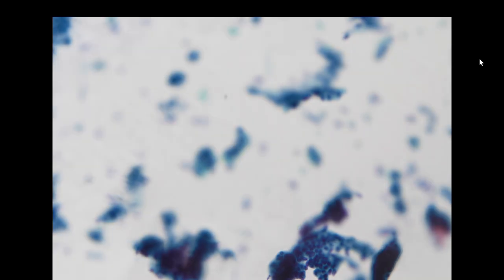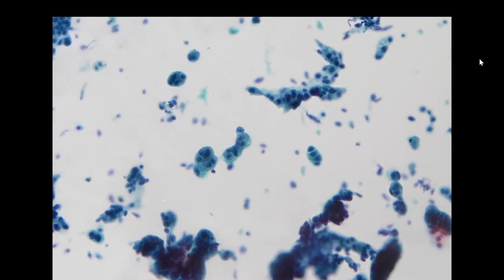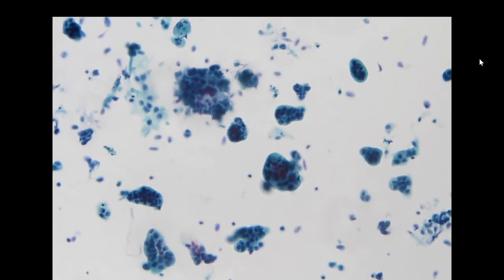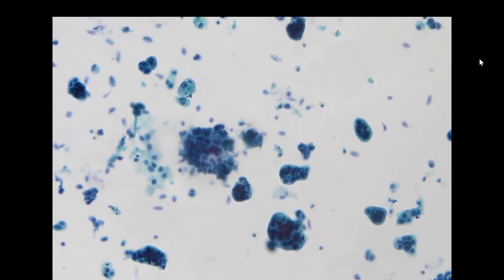So in this scenario, I just ordered three lineage-specific markers. First of all, TTF1, just to check, because lung cancer is still very common. The second is CDX2, because I think it's also highly likely that it is coming from the GI tract.